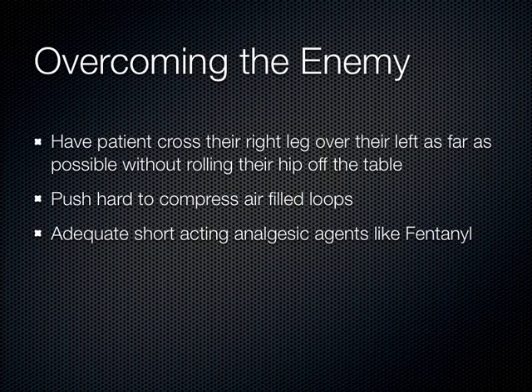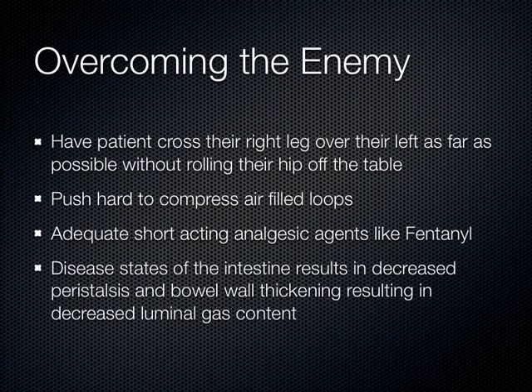People say ultrasound is a very operator-dependent thing. Some people are good at finding the appendix, some people aren't. No. Appendicitis is a very fentanyl-dependent thing. You guys know what fentanyl is, a narcotic, short-acting, lasts 20 minutes. We use it a lot in patients who have acute pain in the emergency department. I can give somebody a good slug of fentanyl, and it really does take the edge off their pain so that I can compress and get into their abdomen using ultrasound. It's a much more humane way than what we're going to do today to our models.